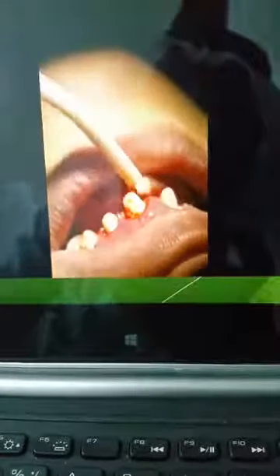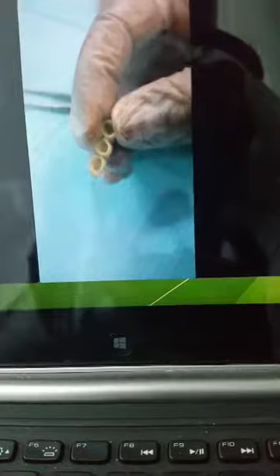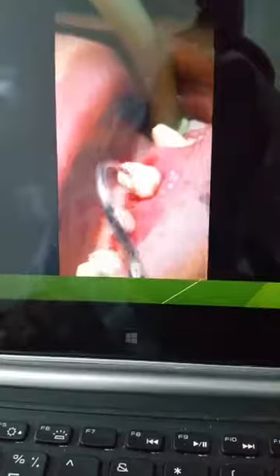Without the laser it is difficult, but here with the laser it was easily removed, and you could see inside was very clean, with no cement sticking on the teeth. So this is the cement from the surface of the prosthesis, and the laser can easily remove it. Now you can see the cement here, and we are trying to remove it. Those are easily removed with the explorer. You can do it simply, but it's hard. You can remove it with the laser.